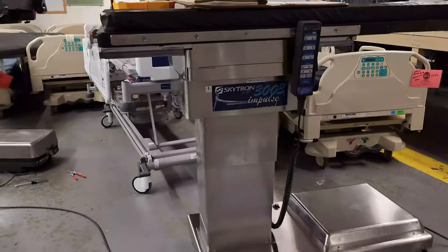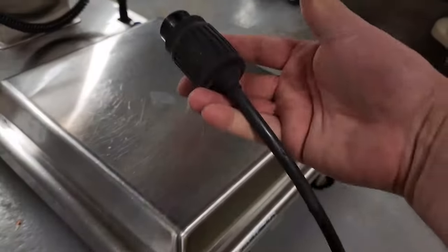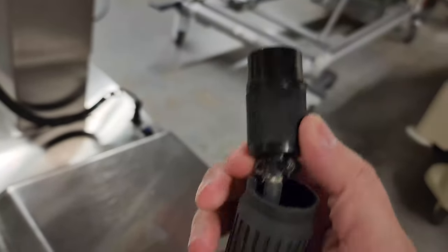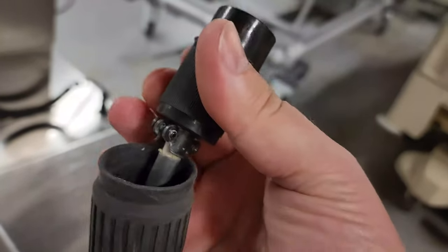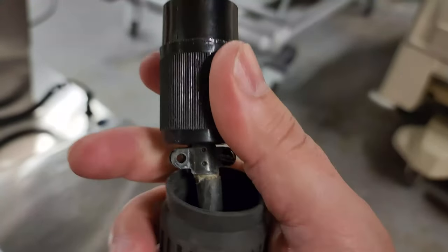Every single one of them has different issues. Here we go — we've got the classic Skytron 3003 Impulse. This one had a few issues. First off, if you guys see this twist lock plug, take a moment and scoot the boot back. Underneath the boot are the hidden surprises. You can see the strain relief is damaged, missing a fastener, and it's no longer on the outer sheathing of the cable, so it is not acting as a real strain relief.